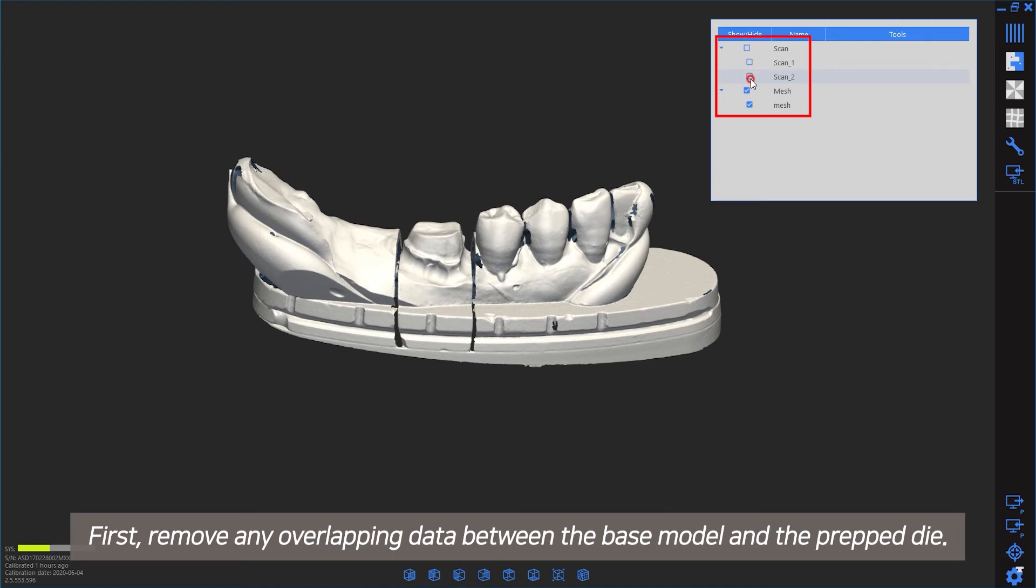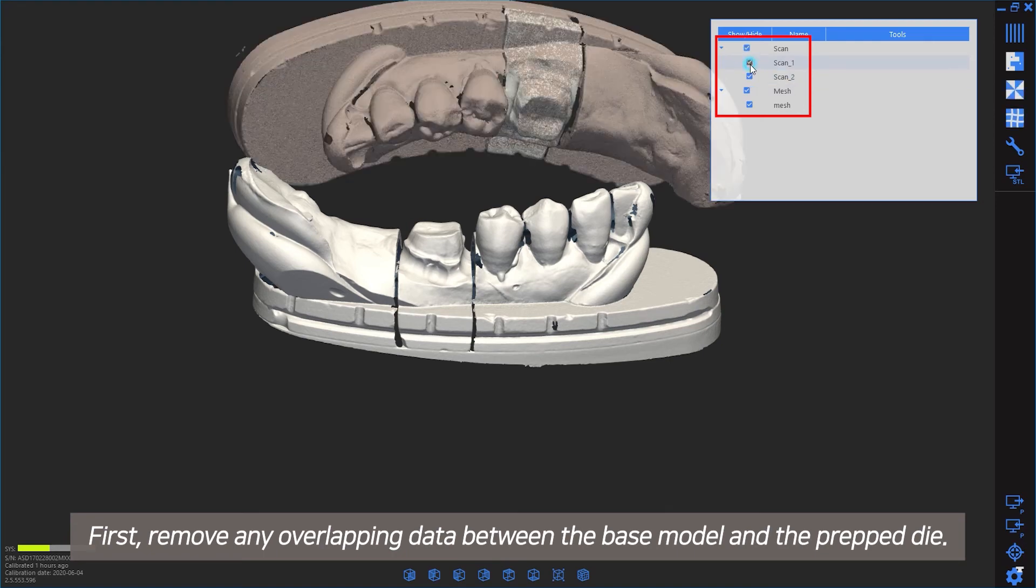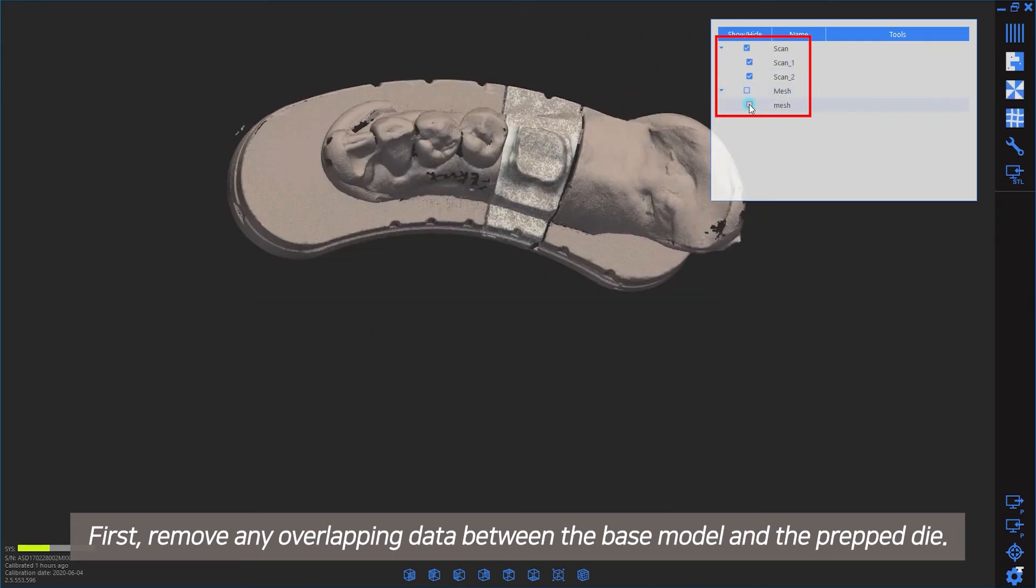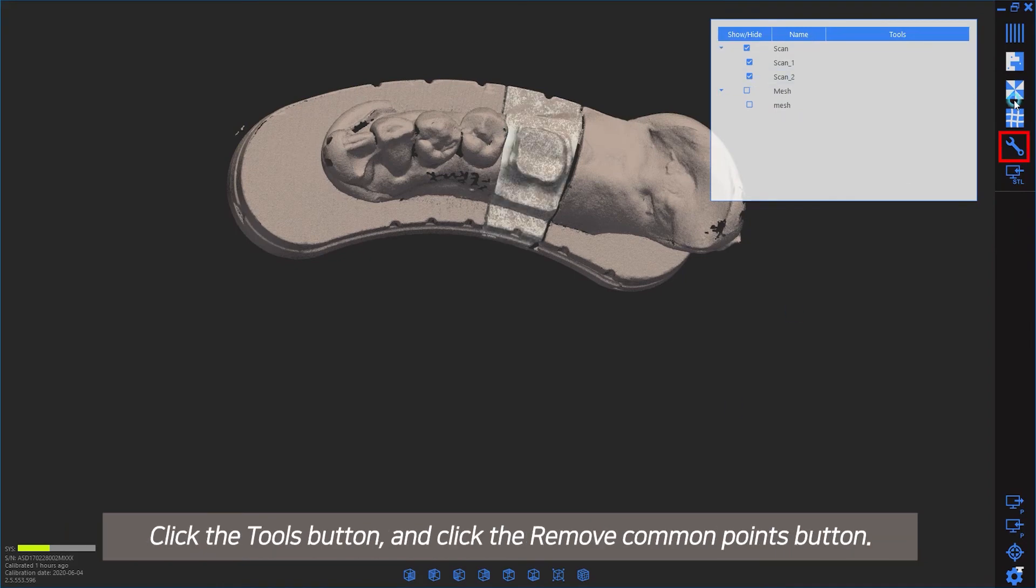First, remove any overlapping data between the base model and the prepped die. Click the Tools button, then click the Remove Common Points button.